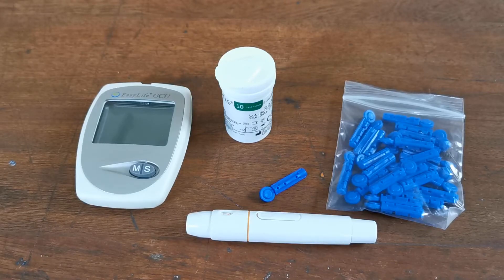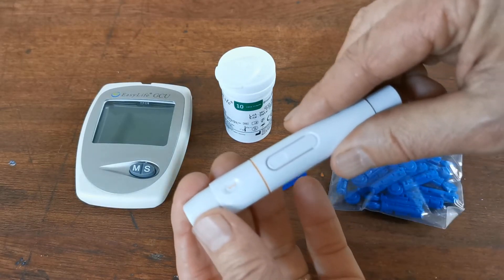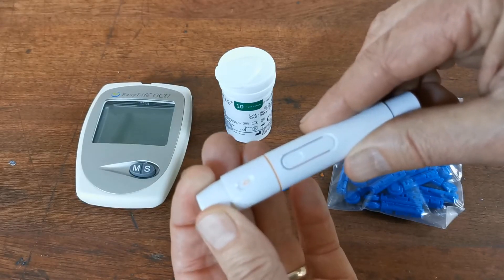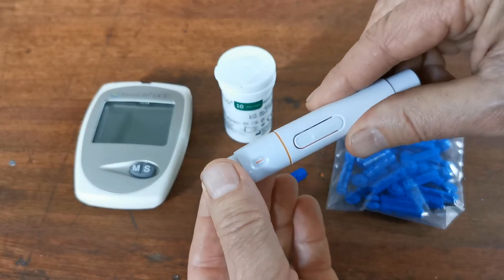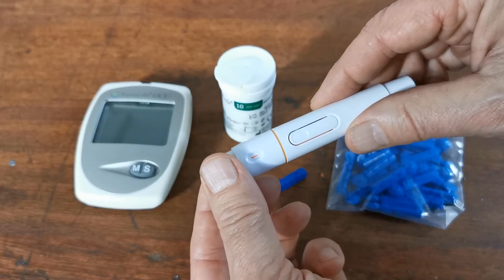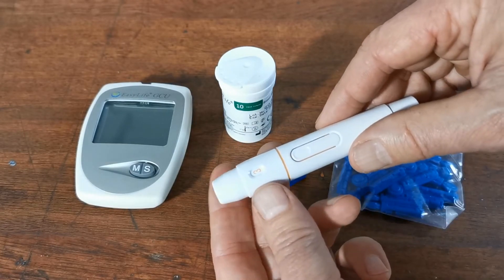This video is going to show you how to do a test using the EZLife GCU meter. We're going to set you going as if this is the very first test you've run on this meter using this batch of test strips. On your lancing device you'll see that the end rotates and in the window you'll see numbers from one to six. Six is the deepest lance, meaning it will go into your skin the deepest; one is the most superficial. Depending on how easily you bleed, find the right depth setting — to start with, go for a medium three.